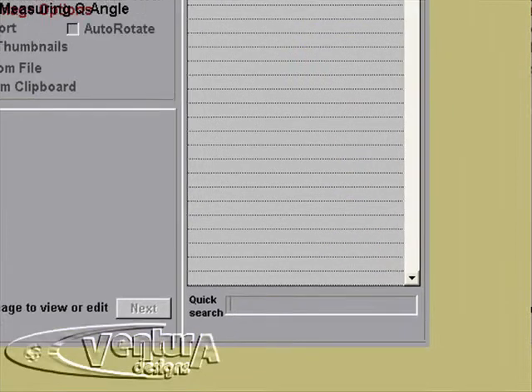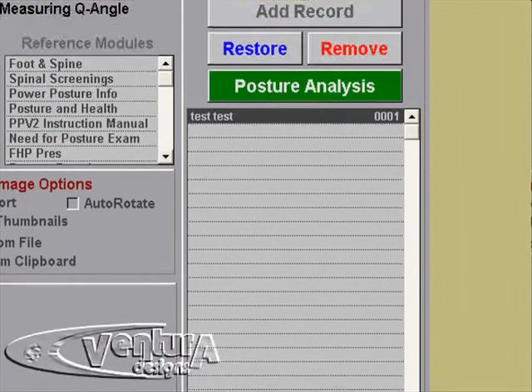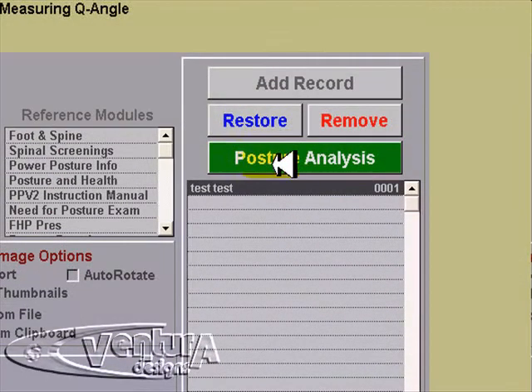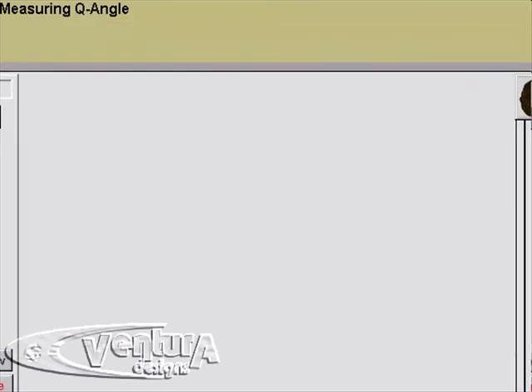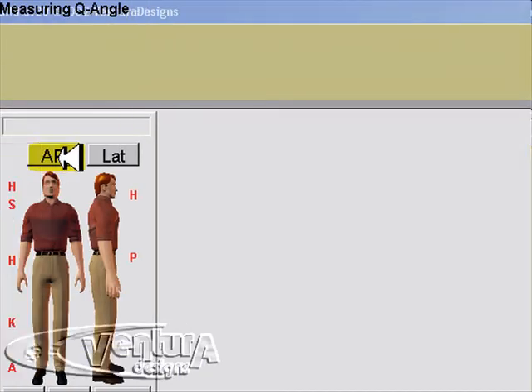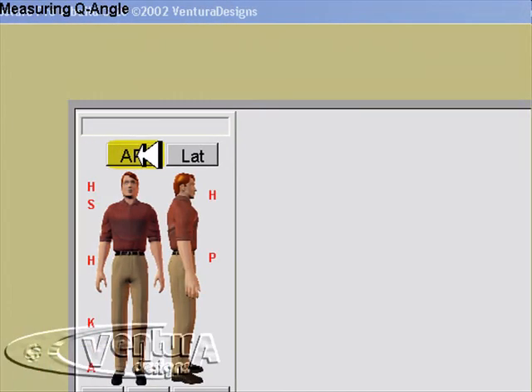To perform a Q-angle exam, you would first enter the posture analysis screen as normal and bring in an anterior-to-posterior picture.